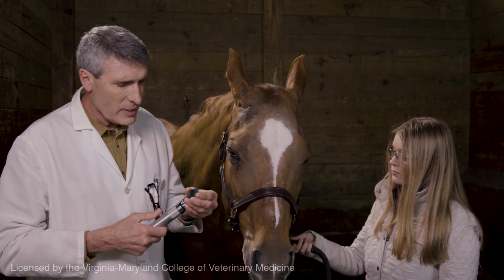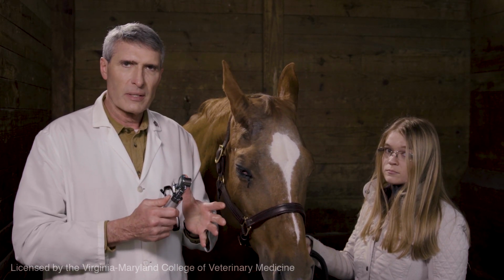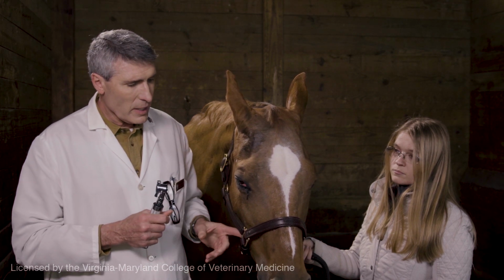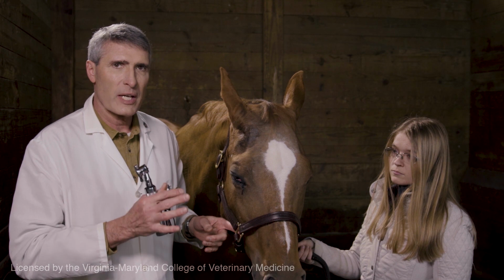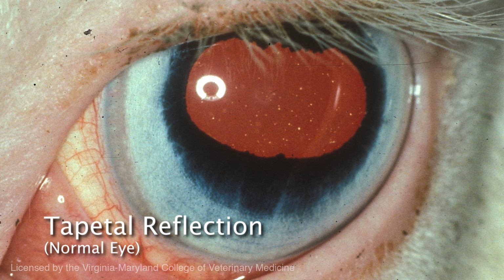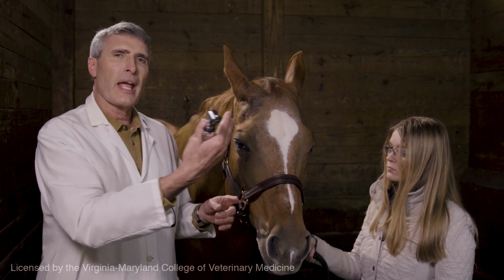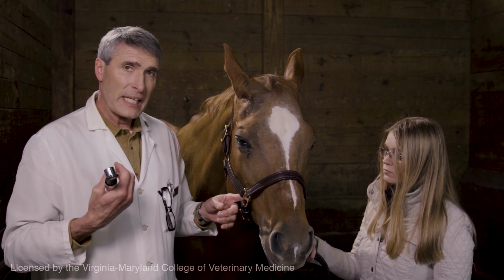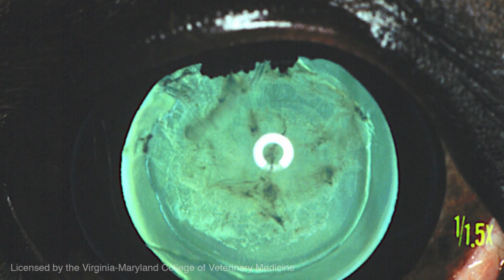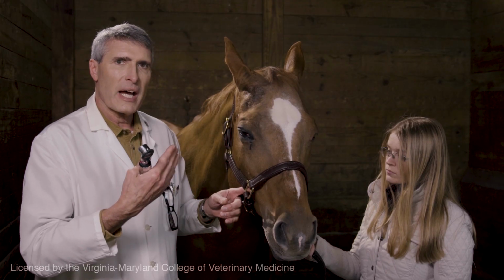Okay, so both of these, the direct ophthalmoscope and the otoscope, have what we call coaxial illumination. The light is coming through the aperture that you are actually looking at. And so this allows you to also develop a concept called retroillumination. If I shine light into a patient's eye, a veterinary patient, dog, cat, horse, cow, you're going to see the bright reflection through their pupil of the tapetum. And anything that is between you and the back of the eye is going to be backlit by the light reflecting from the tapetum. So this is a very good way of picking up little small opacities in the cornea, the lens, the vitreous, or any other portion of the eye that is between you and the back of the eye.